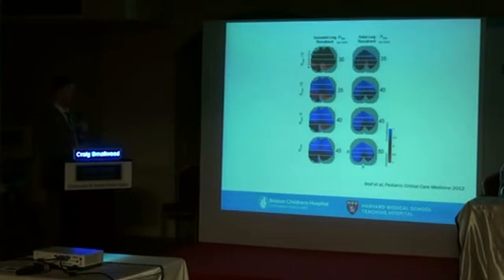We wanted to have an equal distribution of patients who did respond and who didn't, and then we could look at the EIT images, design a protocol, design some processes by which we could predict who was going to respond and not respond, and then use that to infer clinical judgments going forward. But you can see here that primarily what we found was the collapse in region 4 was the most indicative of whether or not you were likely to recruit or not recruit. And that's why I mentioned that this morning, and I'm hoping to convince you of this afternoon.